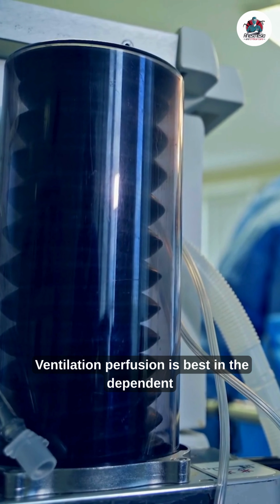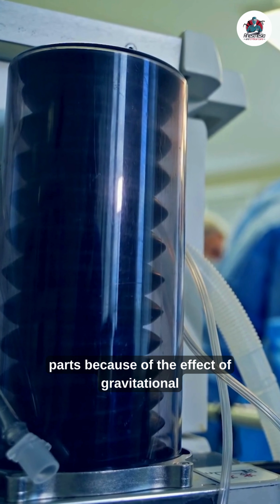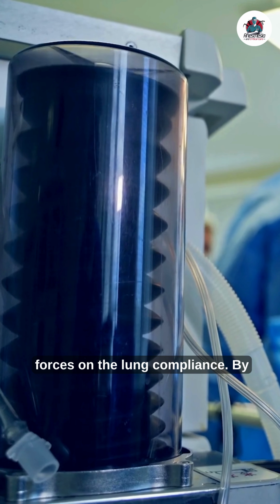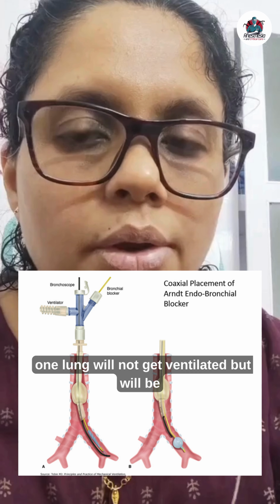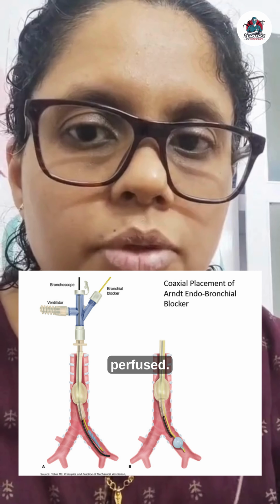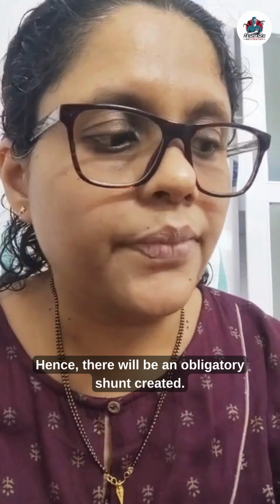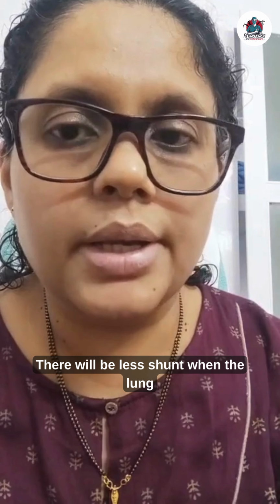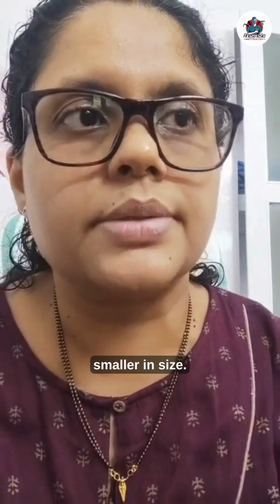Ventilation perfusion is best in the dependent parts because of the effect of gravitational forces on the lung compliance. By initiation of one lung ventilation, one lung will not get ventilated but it will be perfused. Hence, there will be an obligatory shunt created. There will be less shunt when the left lung is isolated, as the left lung is smaller in size.